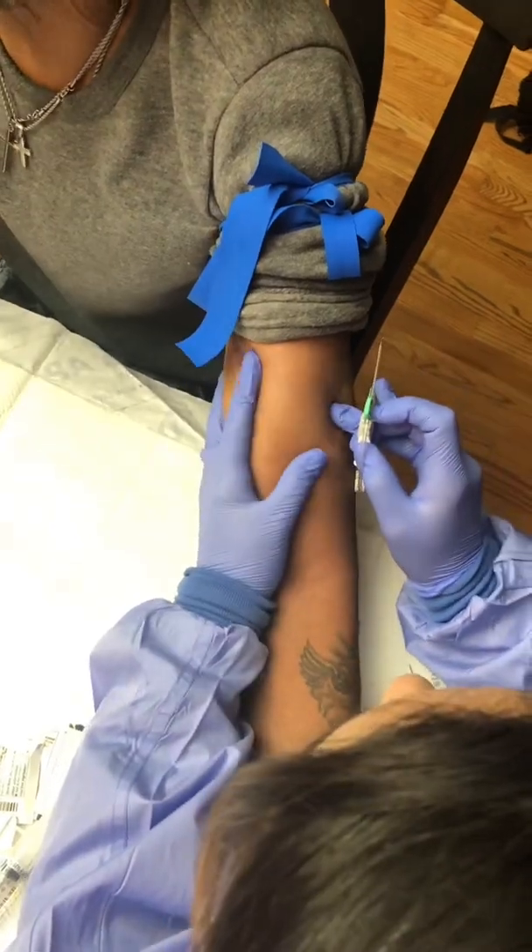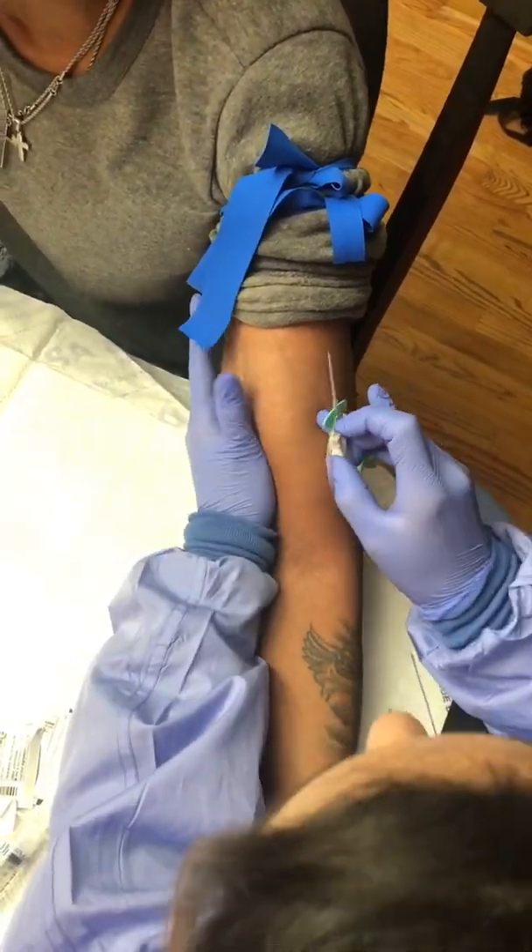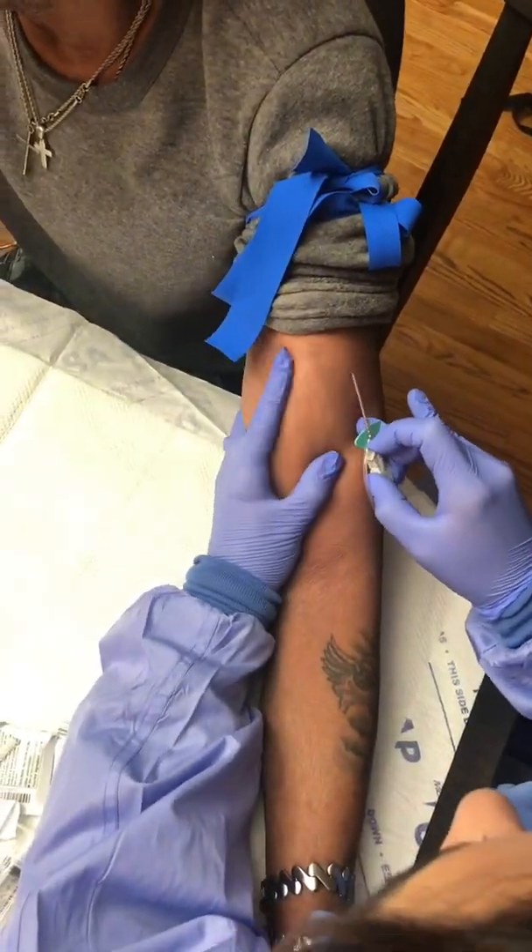Notice how I'm using both of my hands, including the ring finger of my right hand, to hold the skin in place.